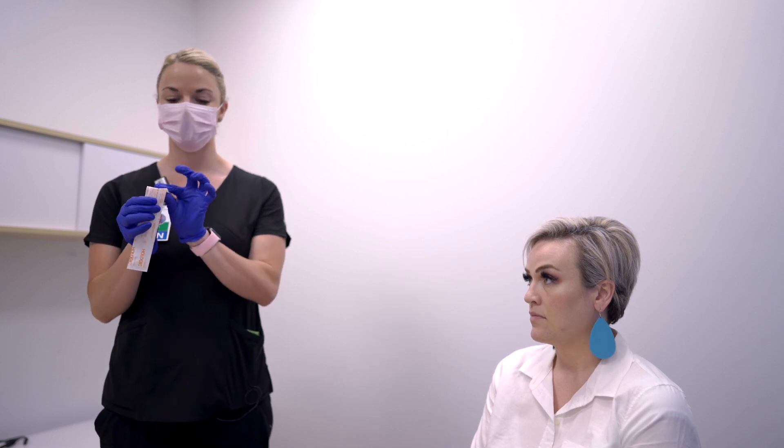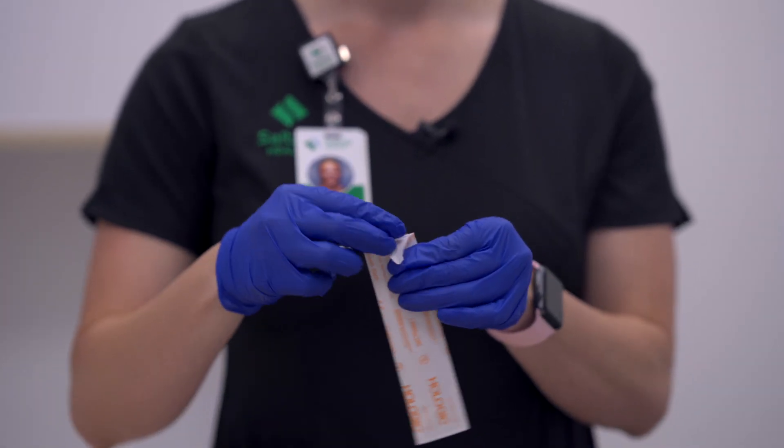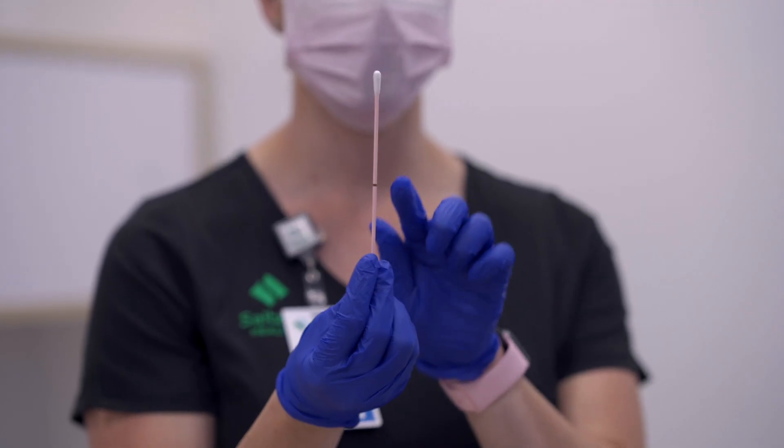Remove the swab from its packaging. You will notice on the swab that there's a black line. This is actually where you break the swab to put it into the tube — that is not how far it needs to go into the nose.